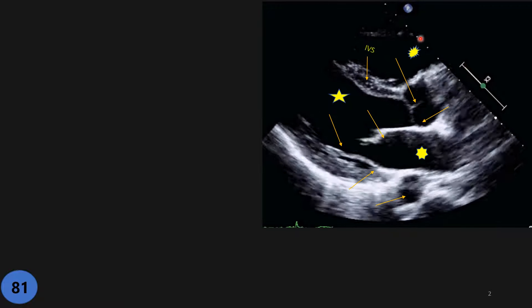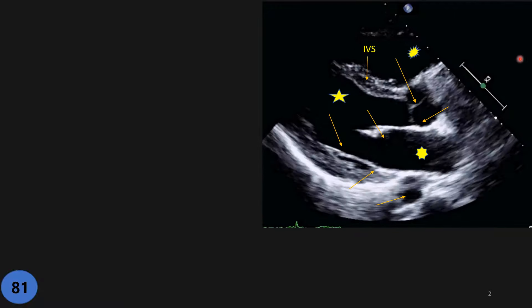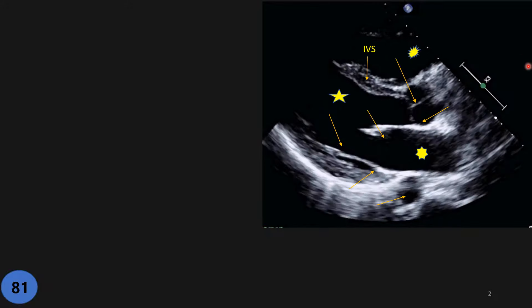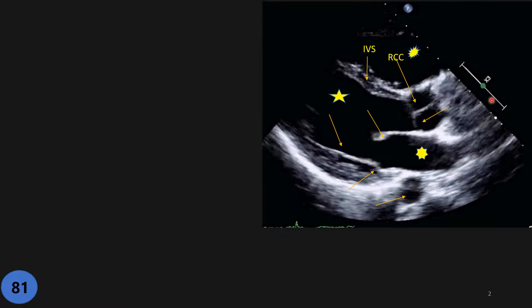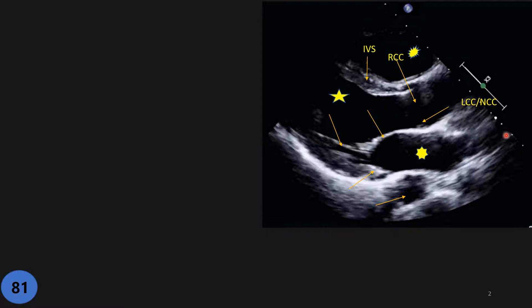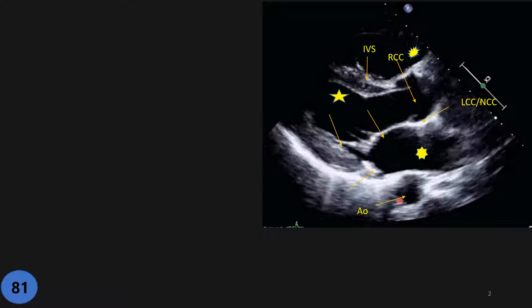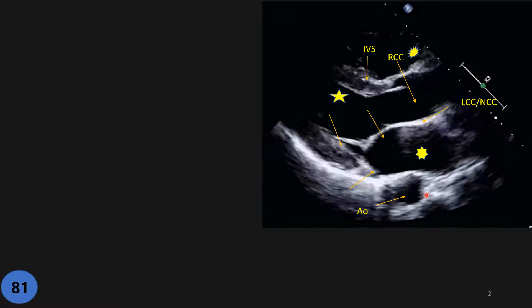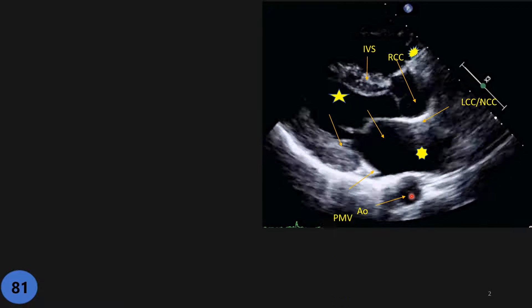The first one is the IVS. This cusp — the anterior one — is the right coronary cusp. The posterior one on the image: we are not sure which one. I will shortly explain — it can be the left coronary cusp or non-coronary cusp. Here we have the left atrium.